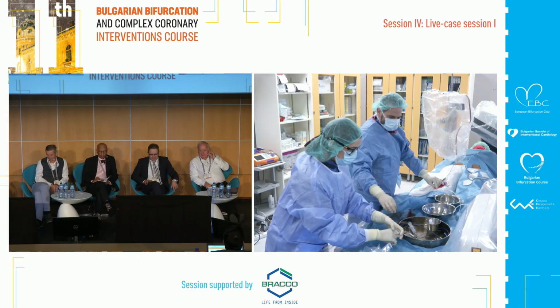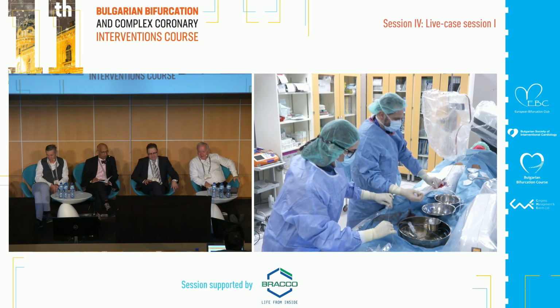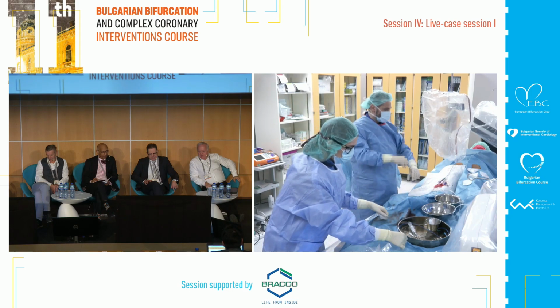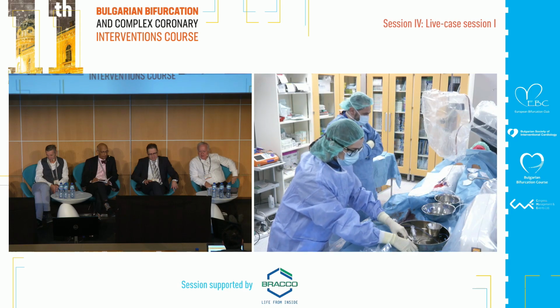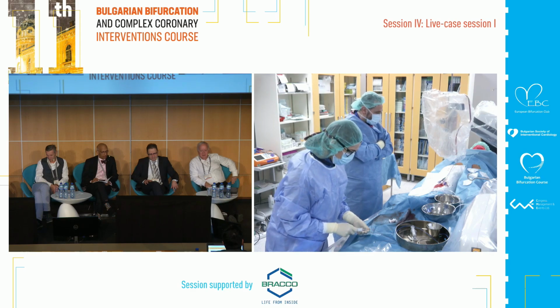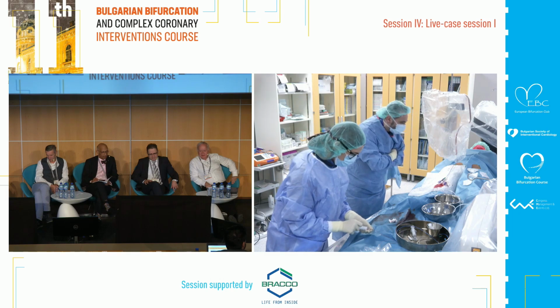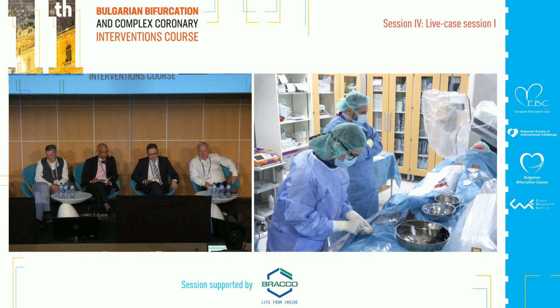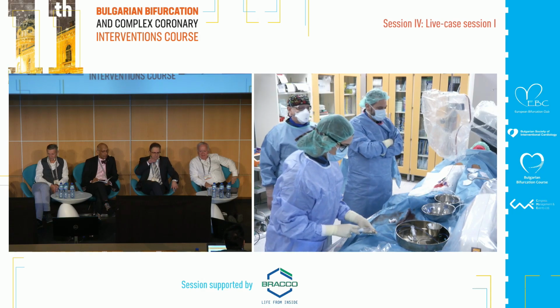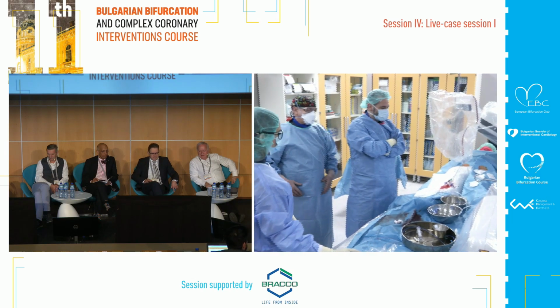Can we stay in this room? Have you injected already the left coronary artery, Gianluca? Do you hear me? Cath lab 1. Gianluca? Valerie, do you hear me? So, George, Yves, can you hear us?